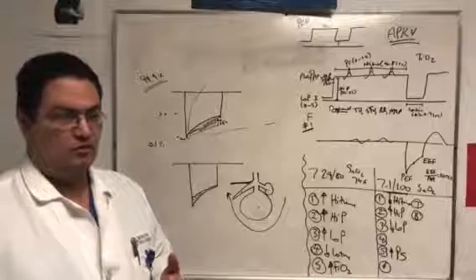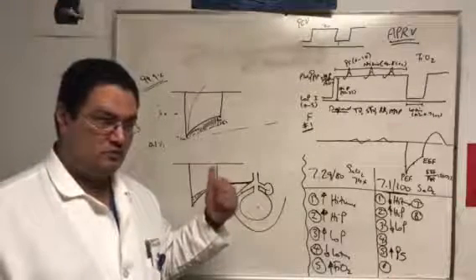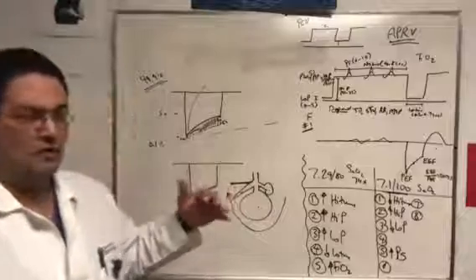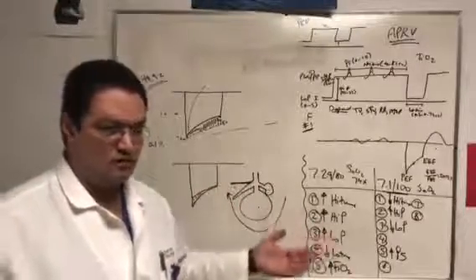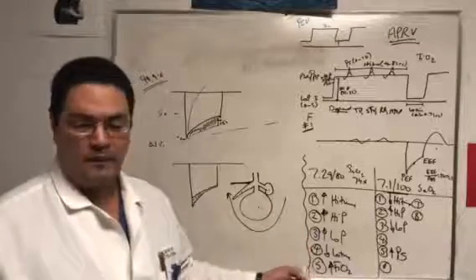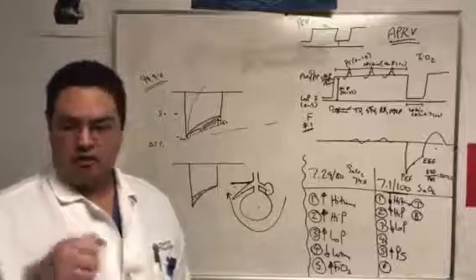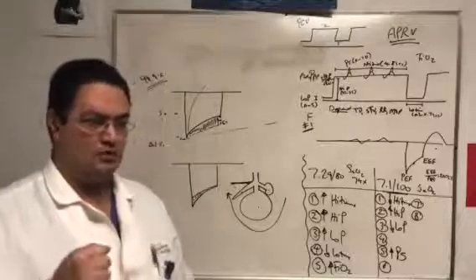So that's number 1. Number 2, this mode of ventilation, another claim to fame. Remember the claims to fame? I don't know how many we have said so far, but another claim to fame to this mode is that it's not only a recruitment and weaning mode, it's a mode of ventilation that improves VQ matching. Why? All the controlled modes of ventilation, volume control, pressure control, all of these things, it gives you pressure.